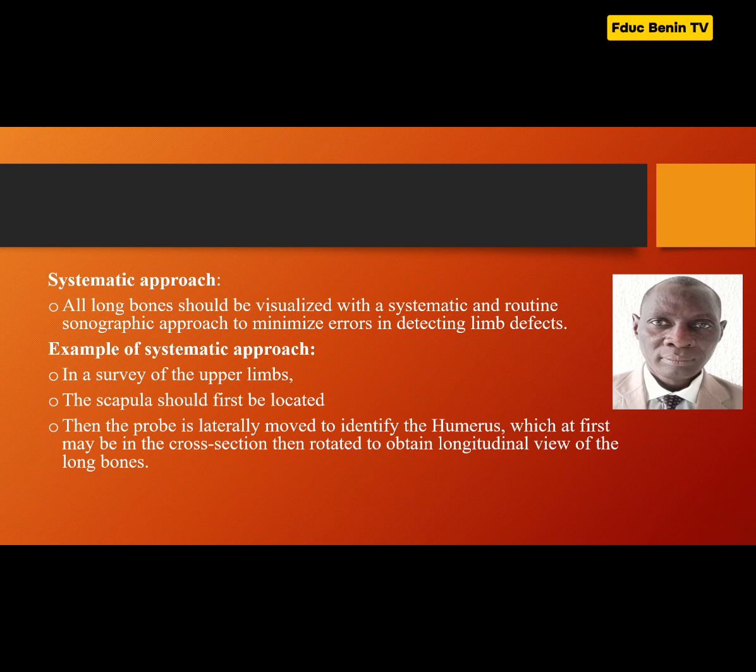Now, again, all long bones should be visualized with a systematic method and routine sonographic approach to minimize errors in detecting limb defects. So being systematic is key to visualization and examination of all long bones. Otherwise, one may incur error while scanning and examining the fetal limbs. Let me give an example of a systematic approach.